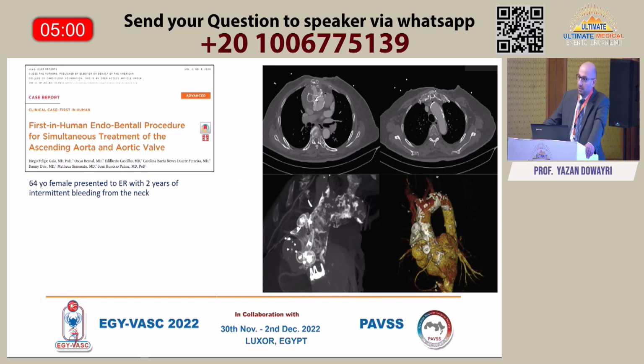Now, an endovascular Bentall procedure has been described at least twice in the published literature so far. None of them was from the United States. One was from Brazil, and there's another paper currently in publication from Germany. This is the first paper. It's the first in-human endo-Bentall procedure.